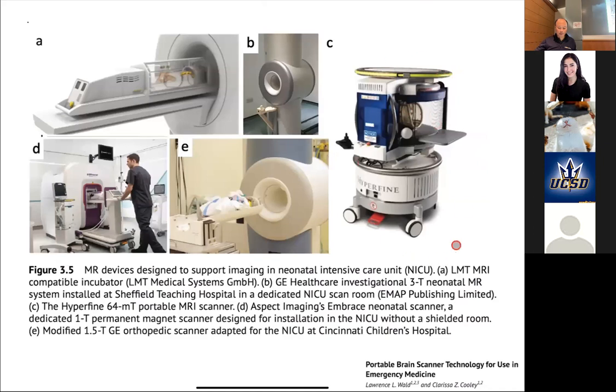We've talked about this before. This is the Hyperfine portable magnet, right? This is actually, I think the Gates Foundation just bought a whole bunch of these and is sending them to Africa and seeing whether that can improve care in Africa.